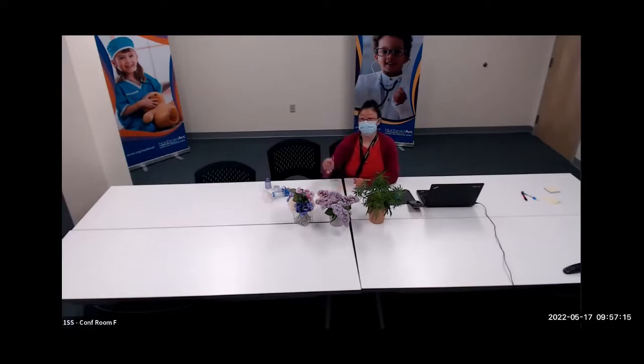You're using, of course, a barely damp Q-tip to do that. You want to make sure that your medication is working before you use the spacer for your clients again. Just give a quick spray and make sure it's working. I have to give 2. I haven't used this in a while, so I actually had to give 2 to make sure it was primed, working, and spraying again. So that's just something I wanted to mention quickly to you.